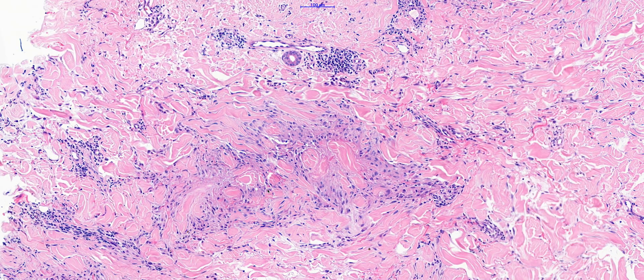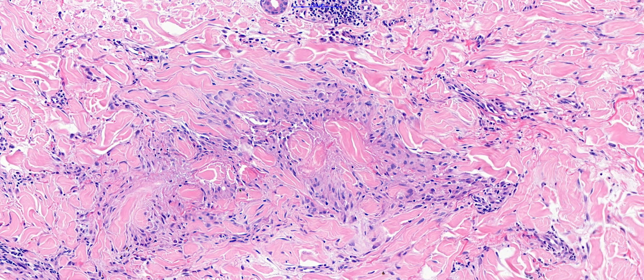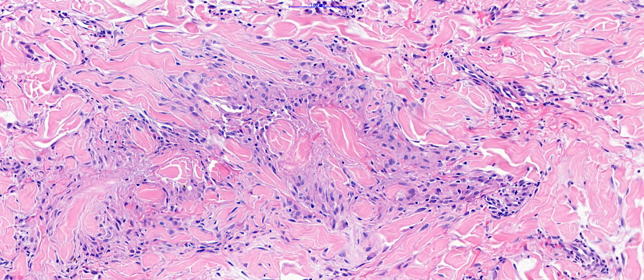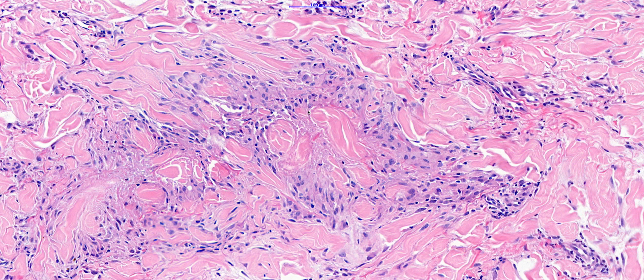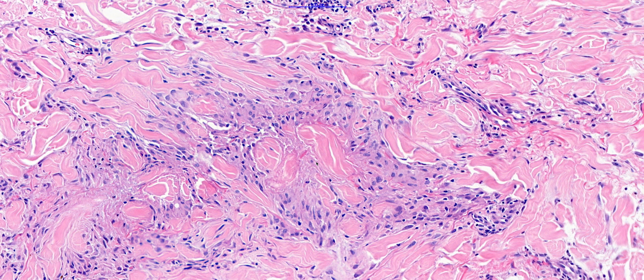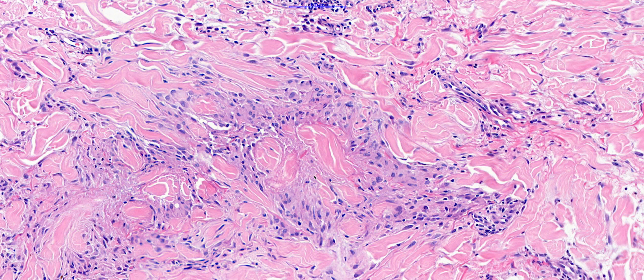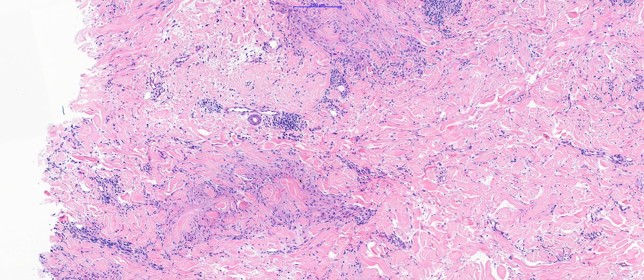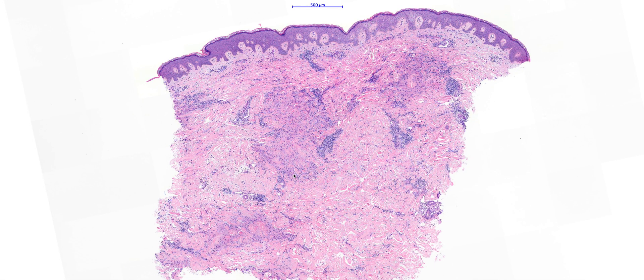Looking at another focus down here, you can see a similar appearance — pale histiocytic cells nicely wrapping themselves around collagen bundles in these areas of necrobiosis. This is quite typical of what you see: focal areas of necrobiotic granulomatous inflammation in the dermis.